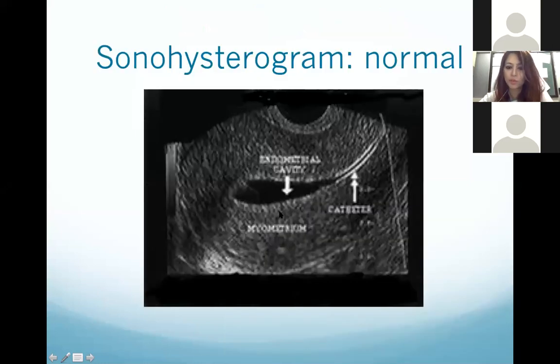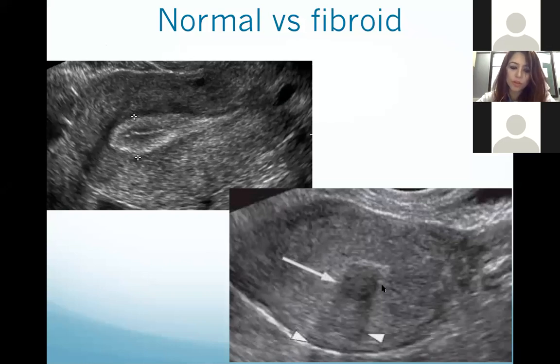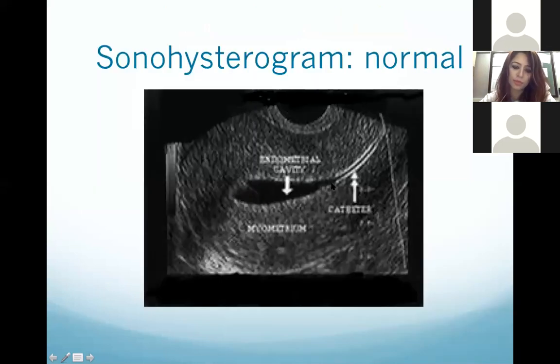This is an image of a sonohysterogram. As I told you, fluid looks black on ultrasound. Here you can see the endometrium with fluid in it, because in sonohysterography we instill fluid within the endometrial cavity to see any endometrial pathology. So this is fluid inside the endometrium.